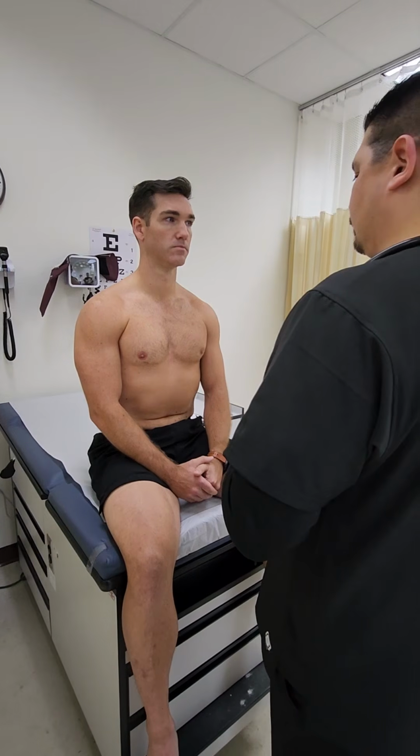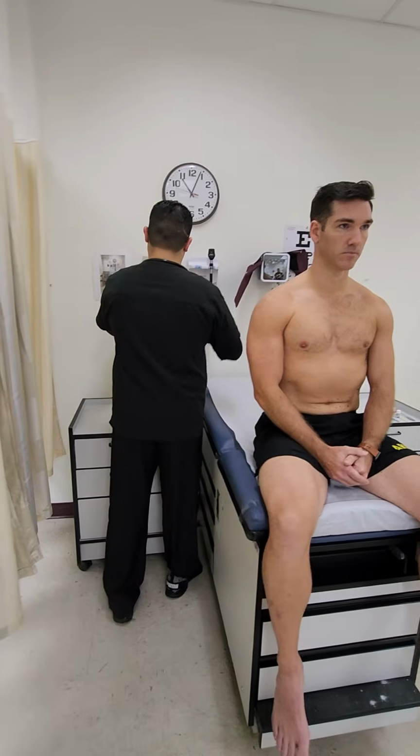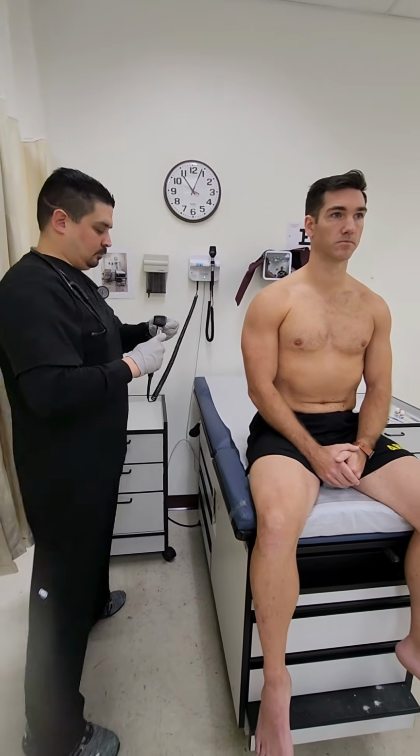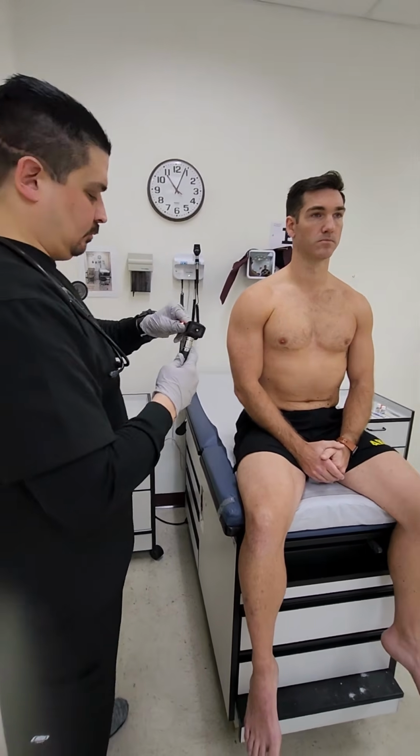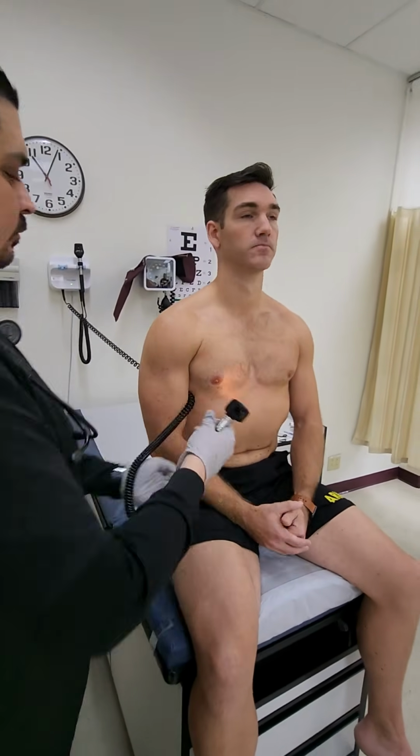Now begins the otoscopic examination. Otoscope exam technique. Brace hand against patient's head or face. Position otoscope at the opening of canal, then peer through lens to visualize entire canal.